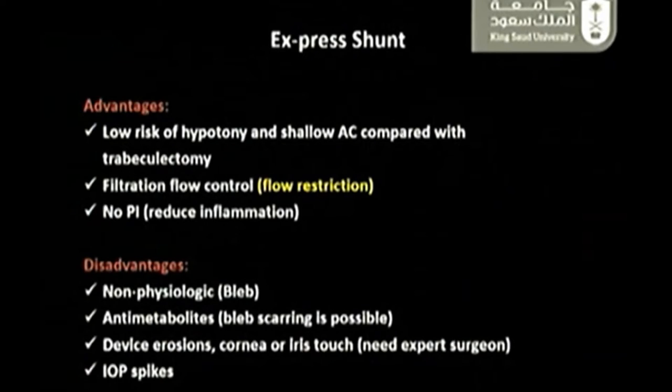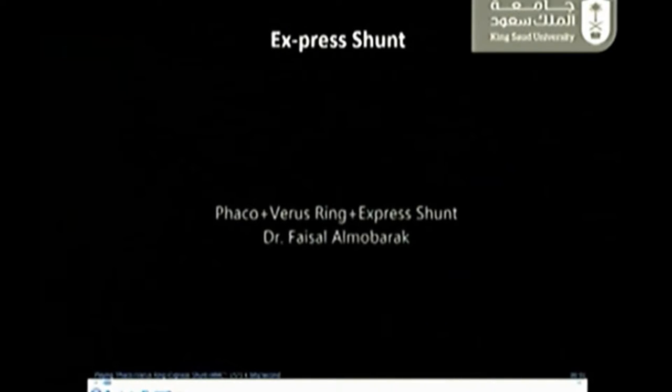It's still non-physiologic, so you'll still have the bleb. You still need to use anti-metabolites, so bleb scarring is possible. The device can erode through the sclera if you don't have a good flap thickness. It can cause corneal decompensation if there is corneal touch. It can sometimes cause chronic iritis, and you might have intermittent IOP spikes as well.